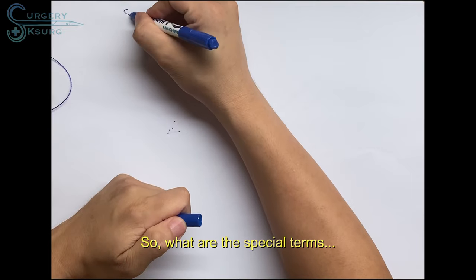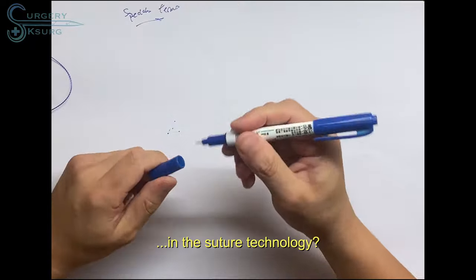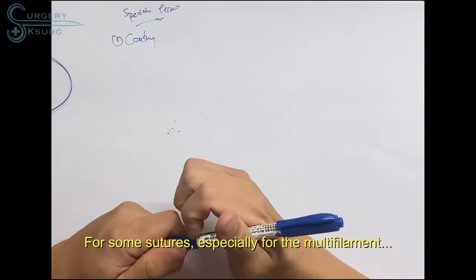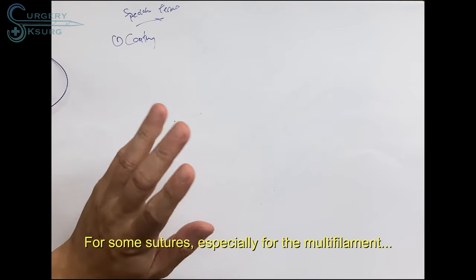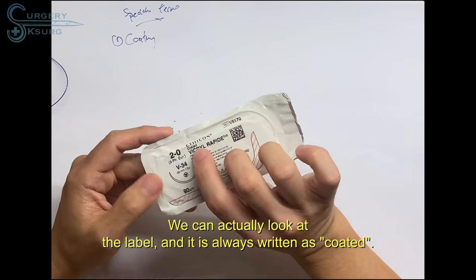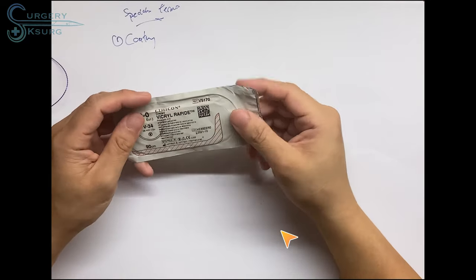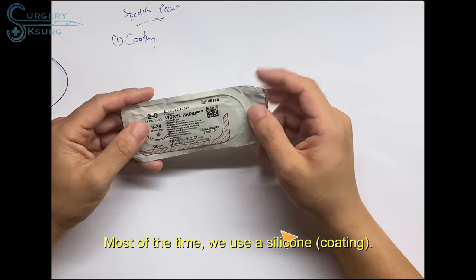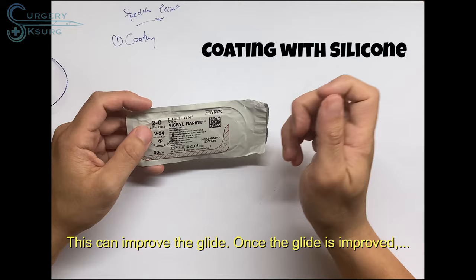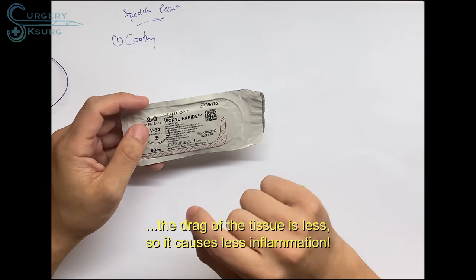So what are the special terms in suture technology? Number one is the coating. Some sutures, especially multifilament or braided sutures, always have a coating. You can look at the label, it's always written there, coated. So what does it coat? Most of the time, it is silicone. This is to improve the glide. Once the glide is improved, the drag on the tissue is less, so it causes less inflammation.